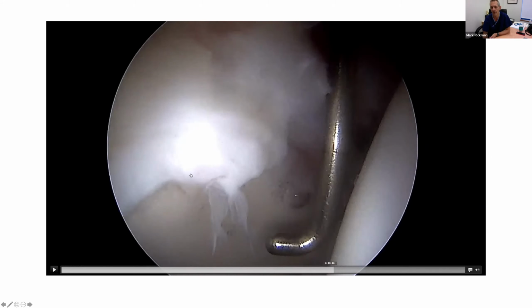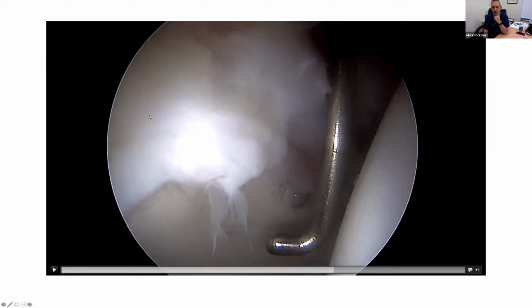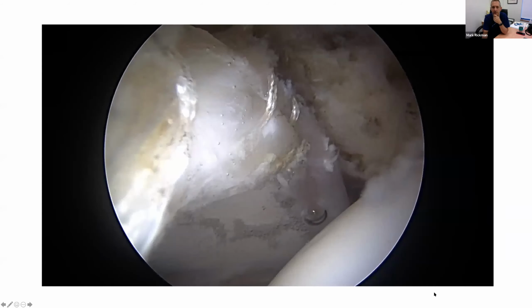And this is pretty bad, but this is a wave sign, and it started to detach down at the bottom. The wave is really just where something's knocking against the top of it. It's always a femoral lesion. The femoral cam hits the edge of the socket, it sneaks in past the labrum and then starts to grind down on the articular surface, and it peels off this articular cartilage. And this is why they're symptomatic. It's this damage, and it's not the bony lump, it's the damage that it's causing.